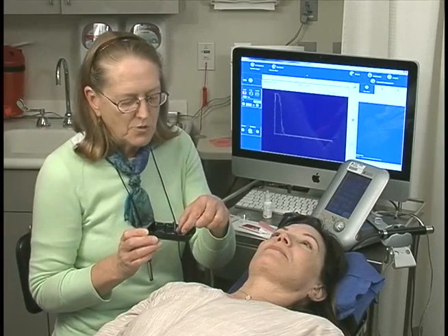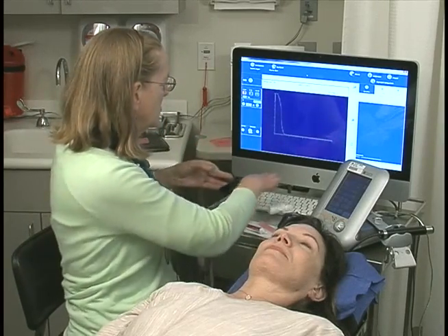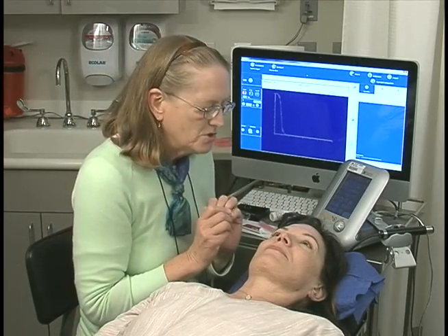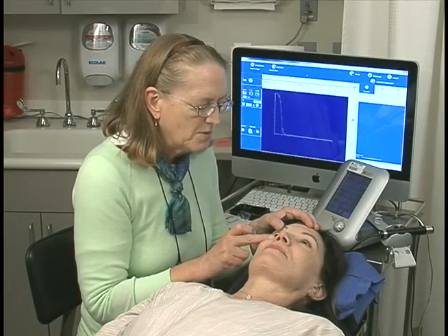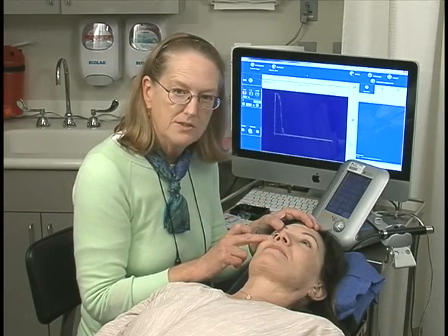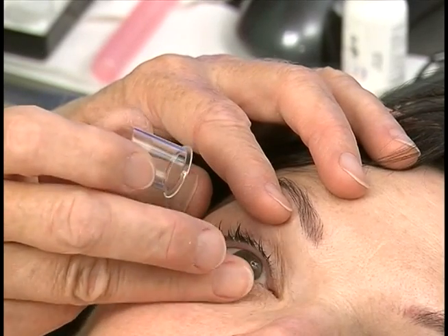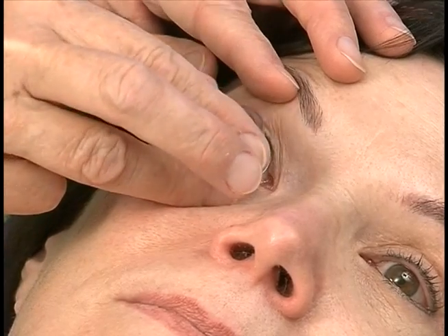I'm going to choose the smallest one that works comfortably for the patient, which in this case is an 18. I normally have the patient in primary gaze, and I spread the lids, making sure I can see a little sclera above and below, and I just place that cup into the lids — under the lids — making sure that it's fitting perfectly.